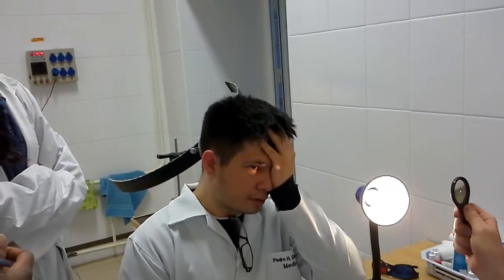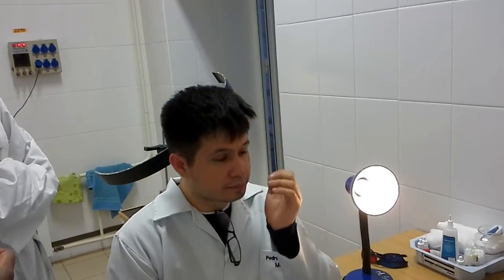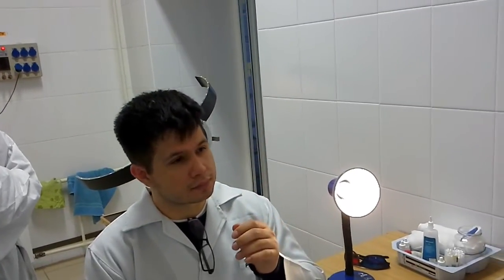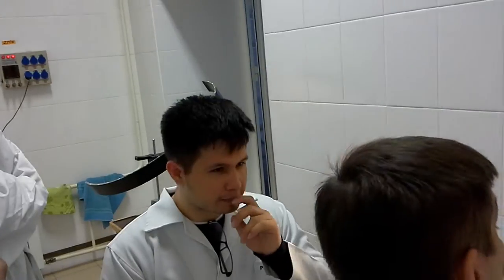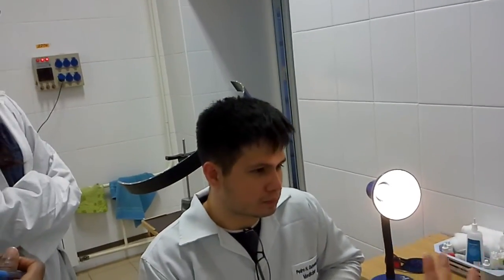Doctor, now where is the light? Left. Okay, and now? Right. Okay. But doctor, he sees your hand going like this or like this. We just simulate the situation. Okay. You want to remove his visual cues. We simulate. You should know and train the technique.